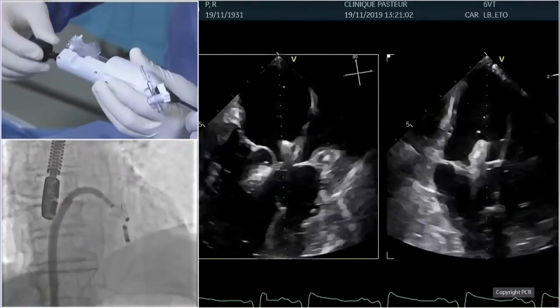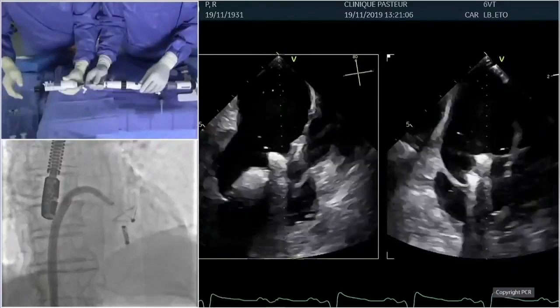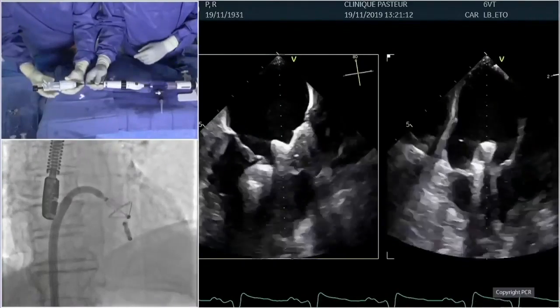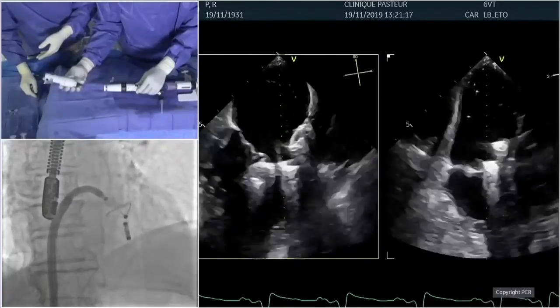Un peu plus au-dessus. Here we are. Okay. We're going to check un peu plus haut parce qu'on est sur la base. And we see that we're totally perpendicular to the first one, so we can directly correct that, Didier, in order to be well aligned.